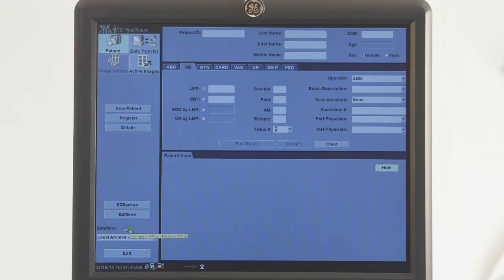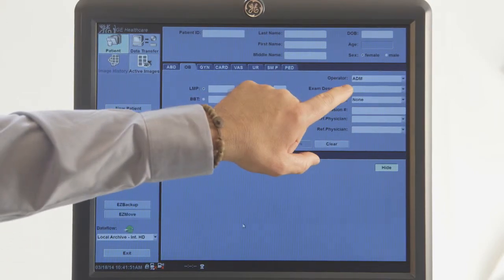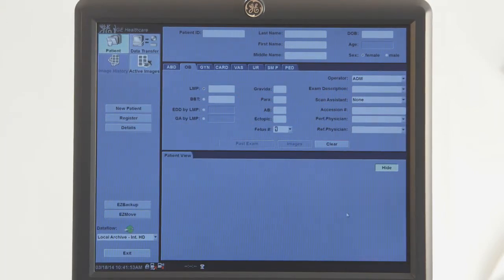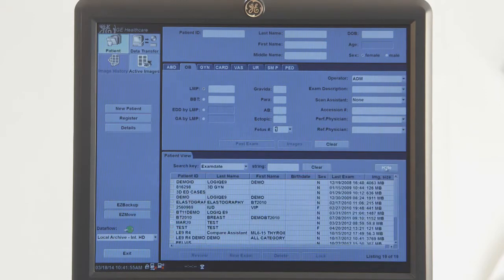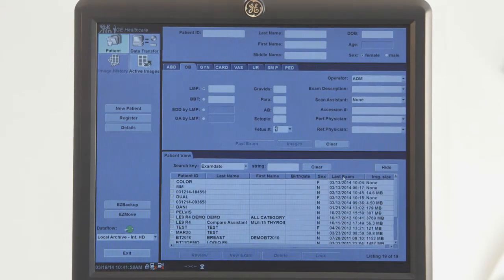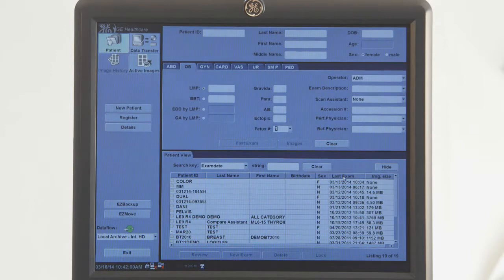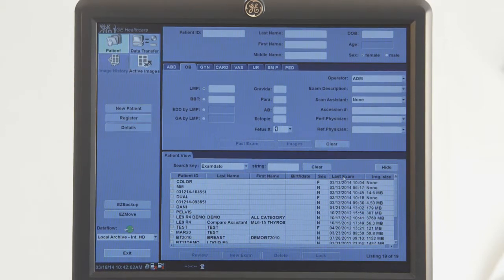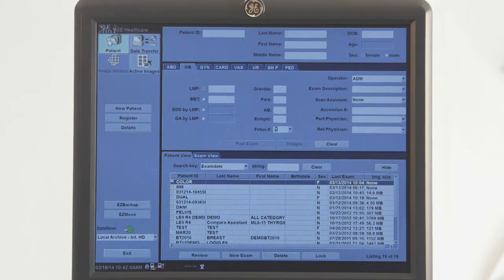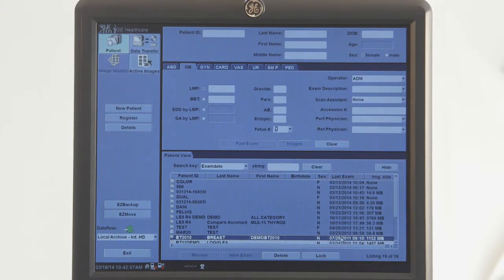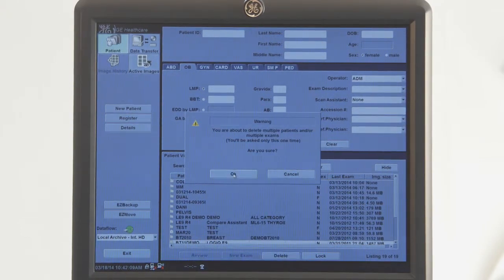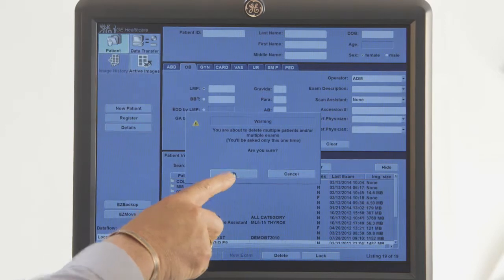When deleting studies from the hard drive, you must have administrative rights or use ADM for the operator. To list the studies in order of the last exam the patient had, click on the header Last Exam. Highlight the patient or patients you wish to delete and then select Delete. If deleting multiple patients, you will be asked if you are sure you want to delete them. Choose OK.